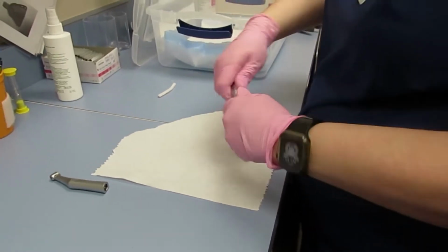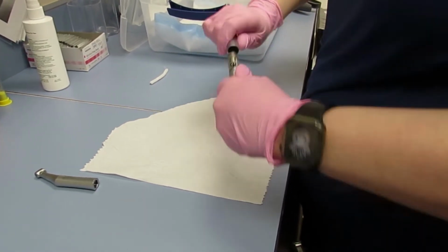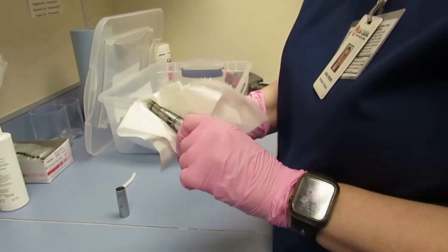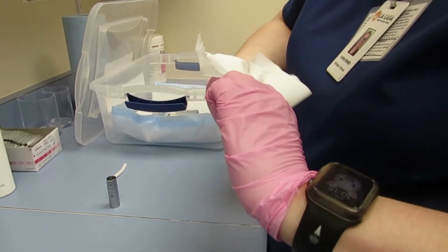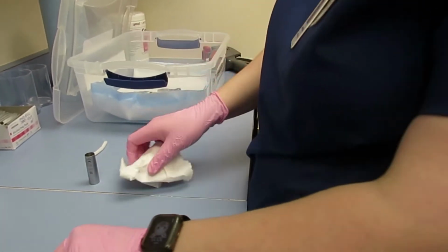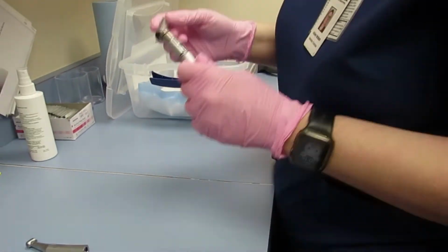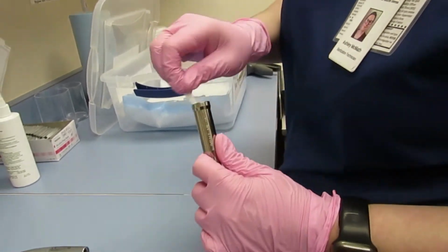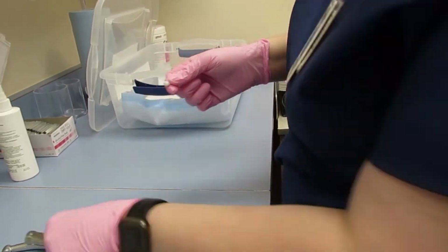This handpiece is a high speed. Some high speeds come apart and some don't. We are going to remove the bottom casing and wipe down the exposed part with a paper towel. As you can see, there is quite a bit of oil left. We are also going to clean the casing and put the high speed back together. This high speed is a surgical handpiece and does not come apart.